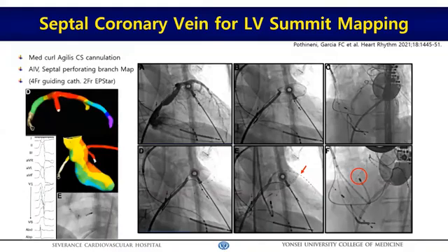Garcia suggested a careful coronary venous mapping, including AIV, septal vein, and perforating veins using 2 French microcatheter, and it is very useful to look for the subepicardial or intramural VT foci. You cannot ablate inside the small coronary vein branches due to the high impedance.